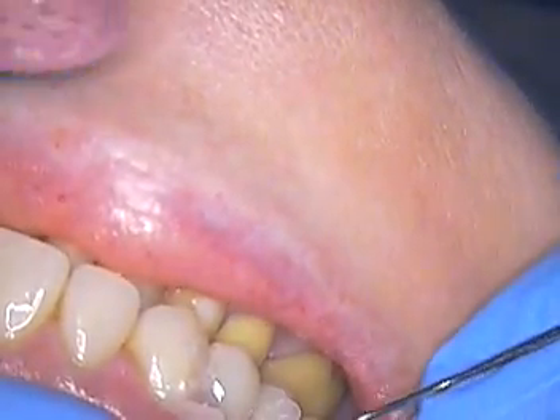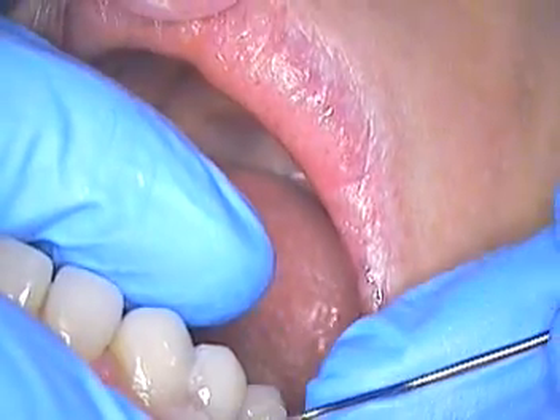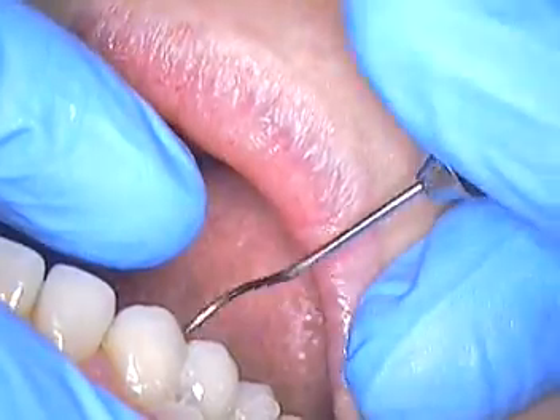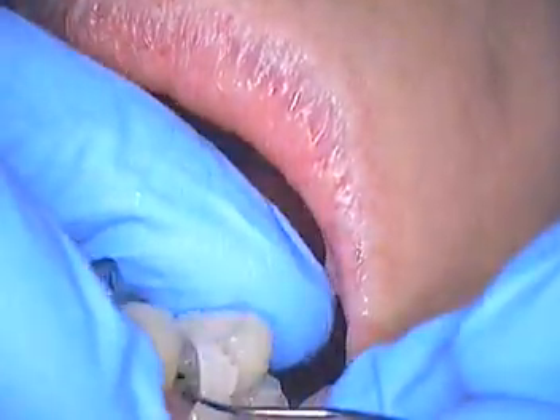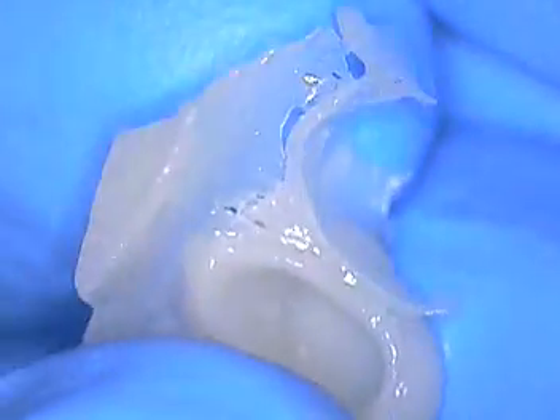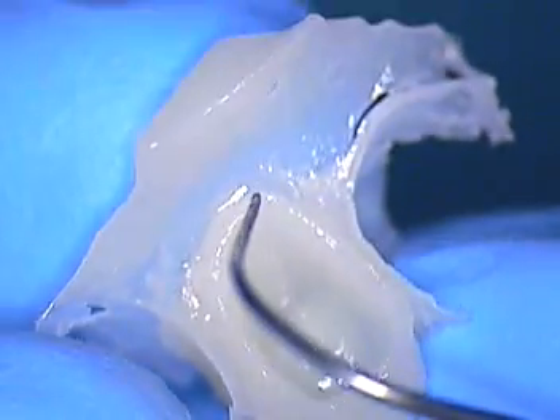Open up and you can see how I'm just going to tease this out gently and check the lingual. Here it comes — and it looks like a winner. I don't see any voids anywhere, it looks good. It looks like we captured our margins, we're going to be in good shape. Off it goes.